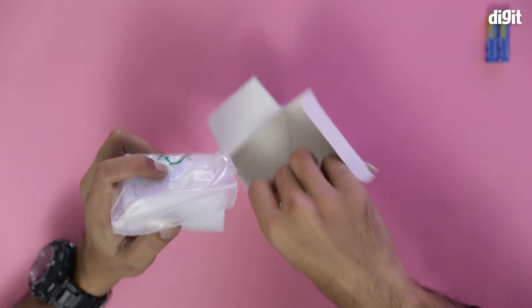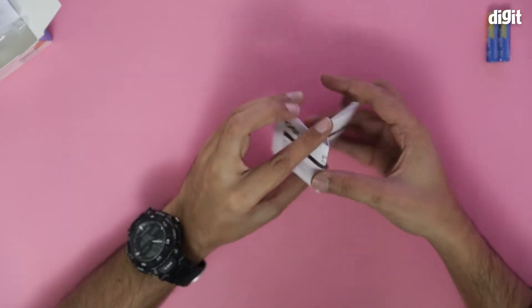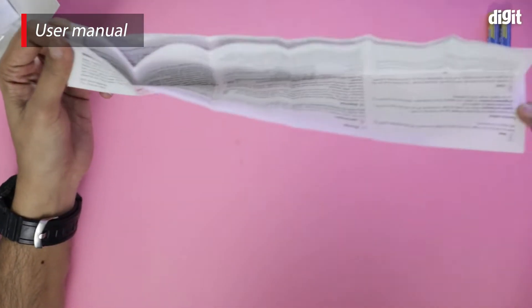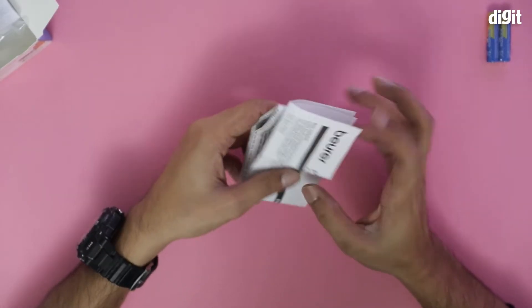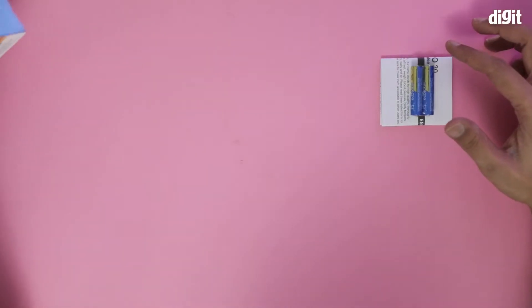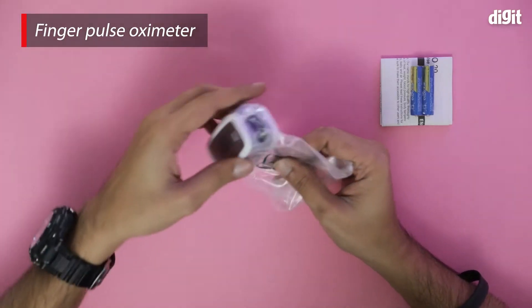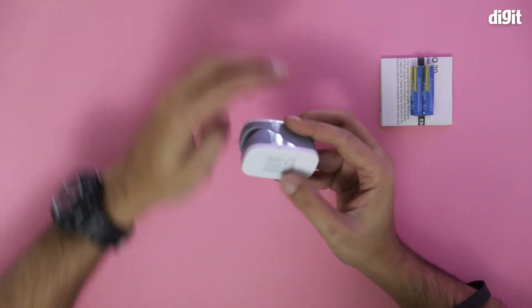There's one document — this is the product information brochure. I'm going to fold it back. Now let's take a look at the oximeter itself. I just packed it, so let me unpack it — there you go.